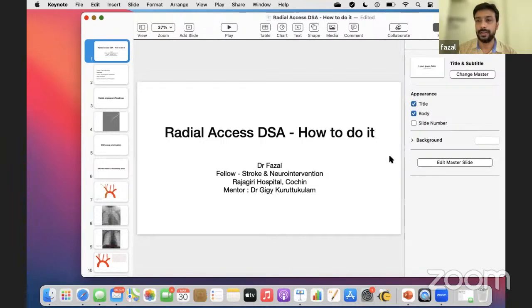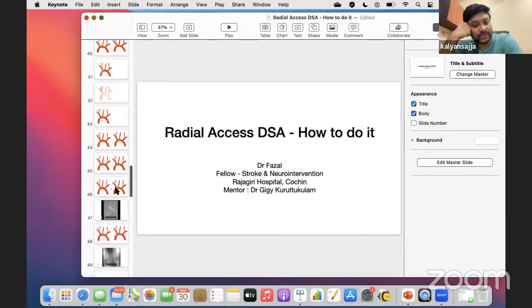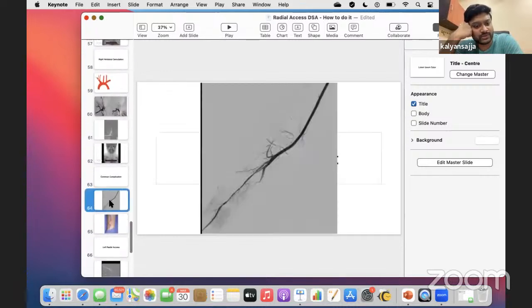One thing you can do is, there was a vasospasm case that you showed almost at the end. Yes. This also seems to be almost like an accessory radial artery. You can still do a diagnostic angiogram through this. If it doesn't go, if it's like a young female and she's feeling uncomfortable, just remove the catheter and apply a nitro patch. There are nitroglycerin patches, which are good for these vasospasms. If you apply it at the site, it usually diffuses and then resolves the spasm.